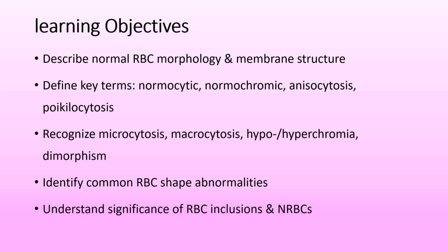You should be able to look at the smear and say not only that there is anemia, but also whether it is normocytic, normochromic, microcytic, hypochromic, or with any other abnormal cell. You will also be able to emphasize the practical significance of each pattern. What is the physiological variant and when should you be alarmed?